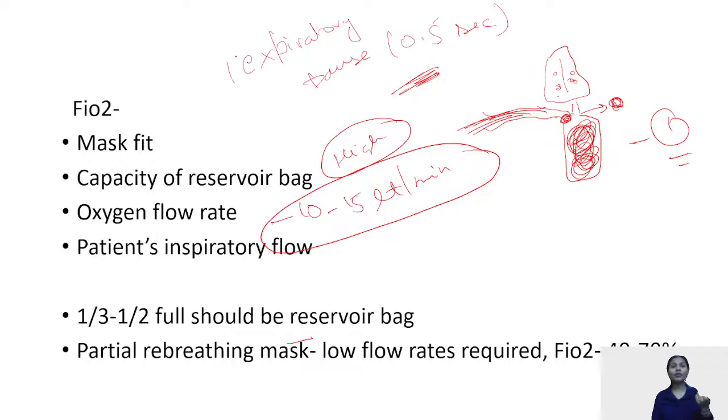So expiratory pause is very important and relevant when we are talking about the oxygen therapy devices, because it is that time when all your capacities, your reservoirs are getting filled with pure oxygen, helping in increasing the FiO2.